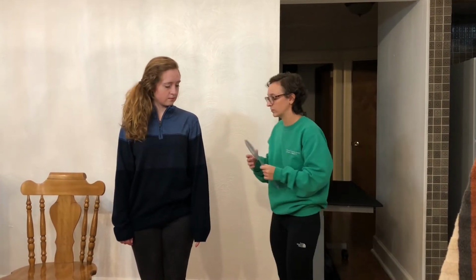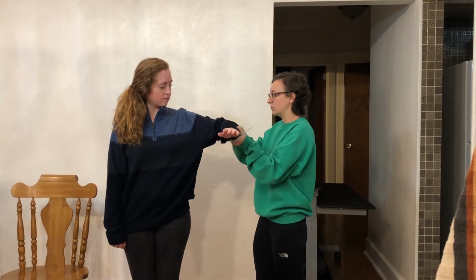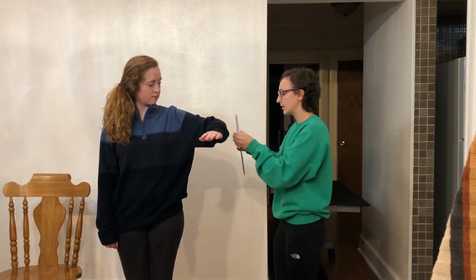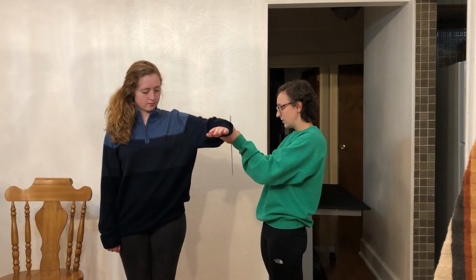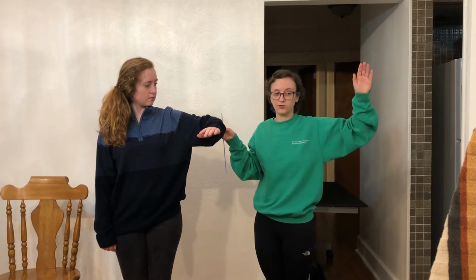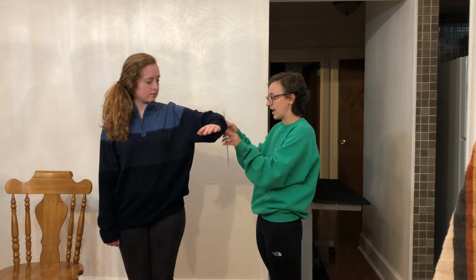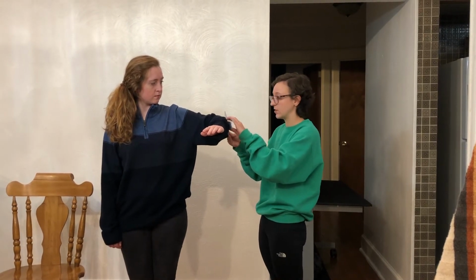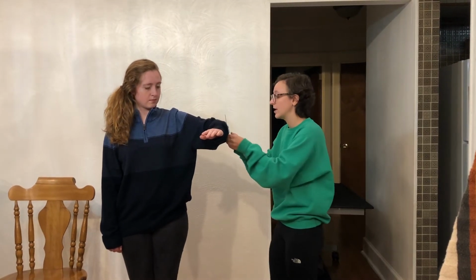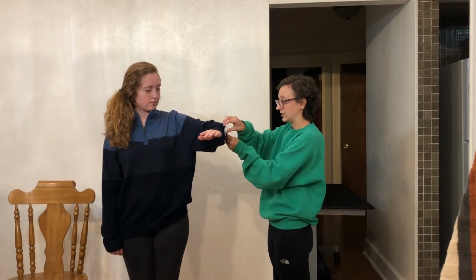Okay, now we're going to do shoulder external and internal rotation. So first I'll do external rotation. What I want you to do is bring your arm here to 90 degrees and 90 degrees of elbow flexion. And I'm going to line my fulcrum up here with the tip of her elbow. And what I want you to do from this position is rotate your hand up toward the sky, just like that. I'm actually going to start, sorry, my apologies. I have my stationary arm lined up with her forearm. And again, I'm going to have you rotate your hand up toward the ceiling whenever you're ready.